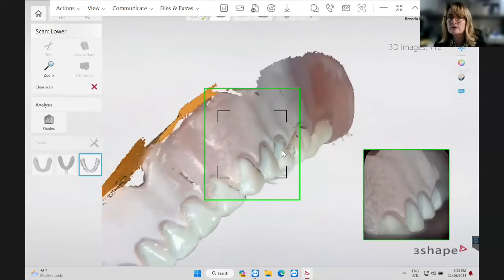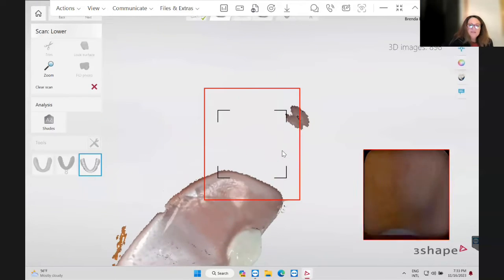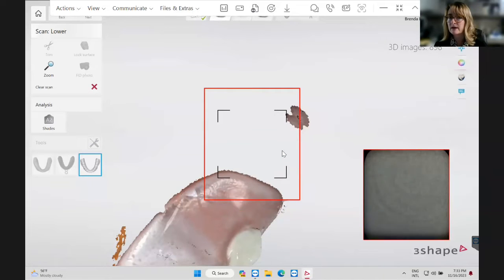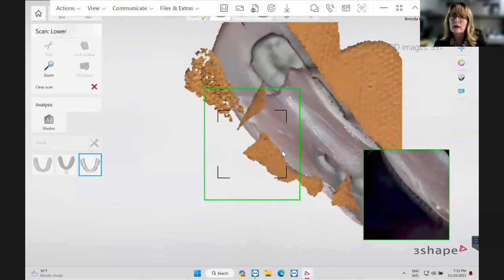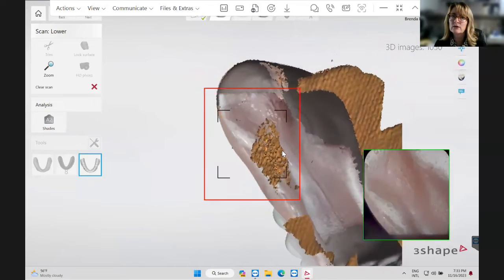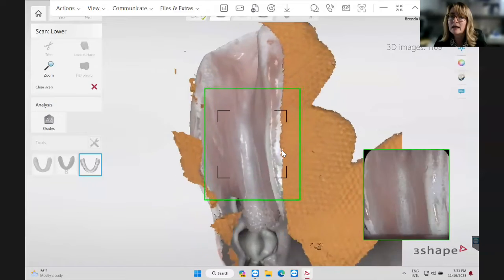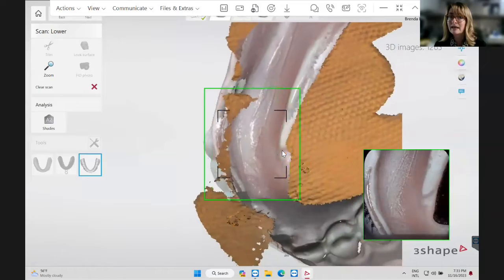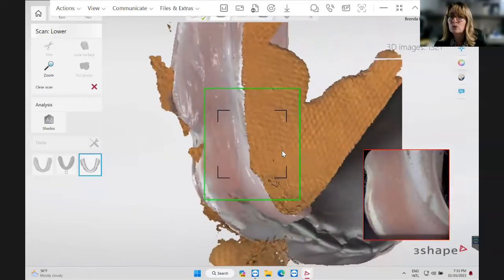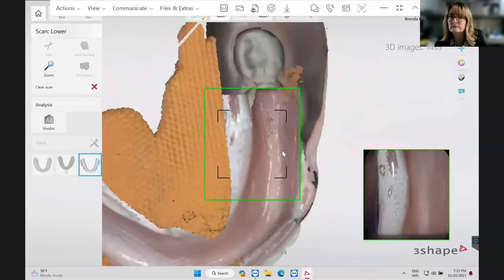So we've known for years about scanning with contrast spray, the Opti spray from CEREC, or titanium dioxide, which is a chemical name. It was a spray with the 3M True Definition scanner years ago, and we were all excited to not have to use powder anymore. However, sometimes with some procedures, it can come in handy as a little tool to acquire the data with greater ease.